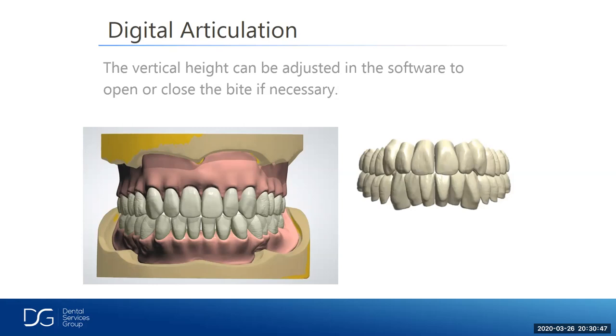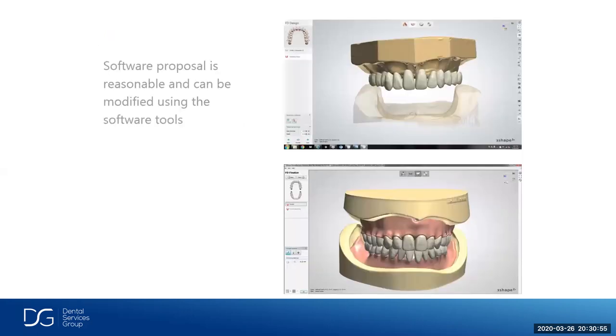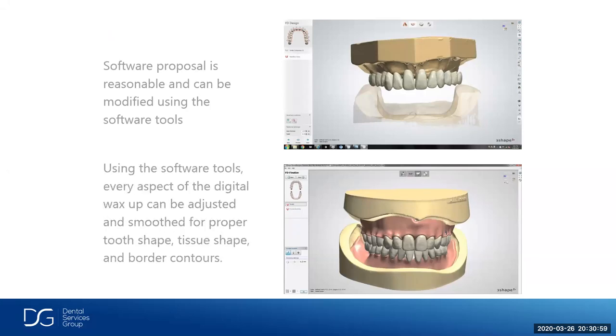And we can also do full arch setups on full upper and full lower, instead of spending a lot of time individually setting teeth the analog way. And the software proposal is reasonable and can be modified using the software tools. And every aspect of the digital wax-up can be adjusted also. We talked about characterized wax-ups before, making all those different carvings and anatomy, and we can do that on the digital side too.